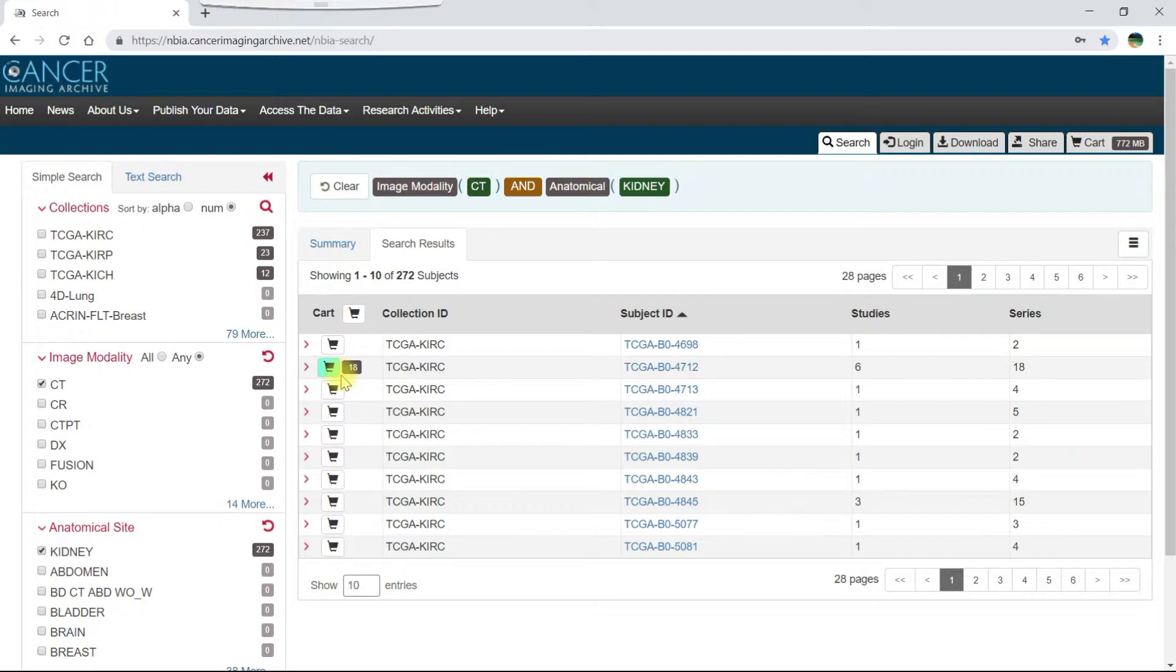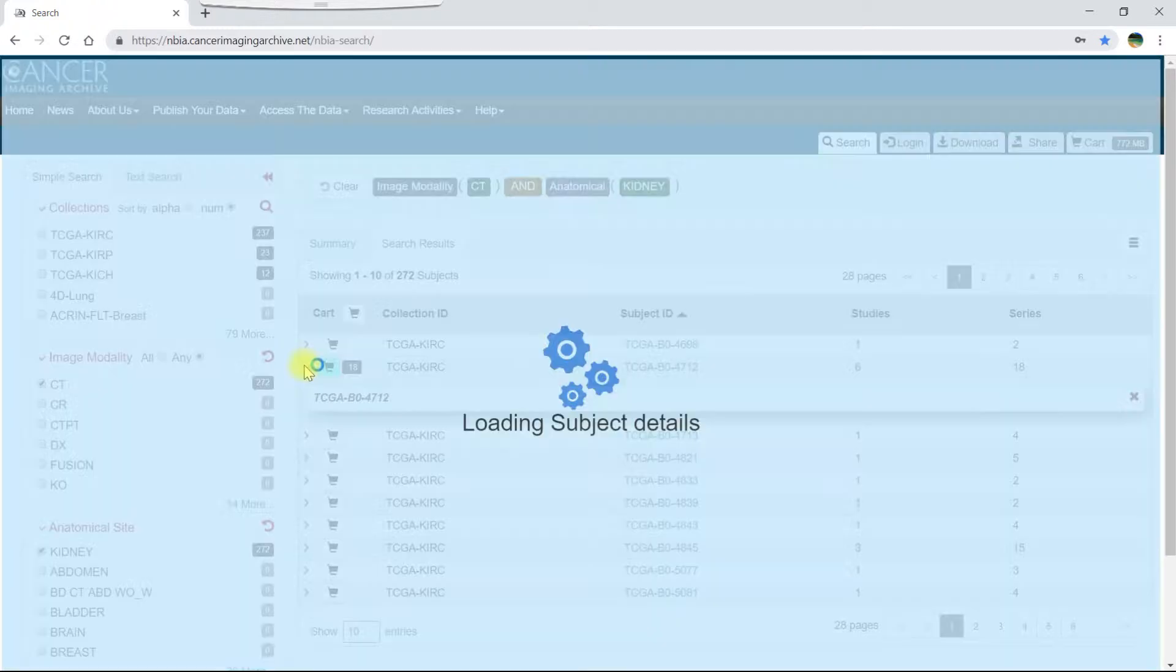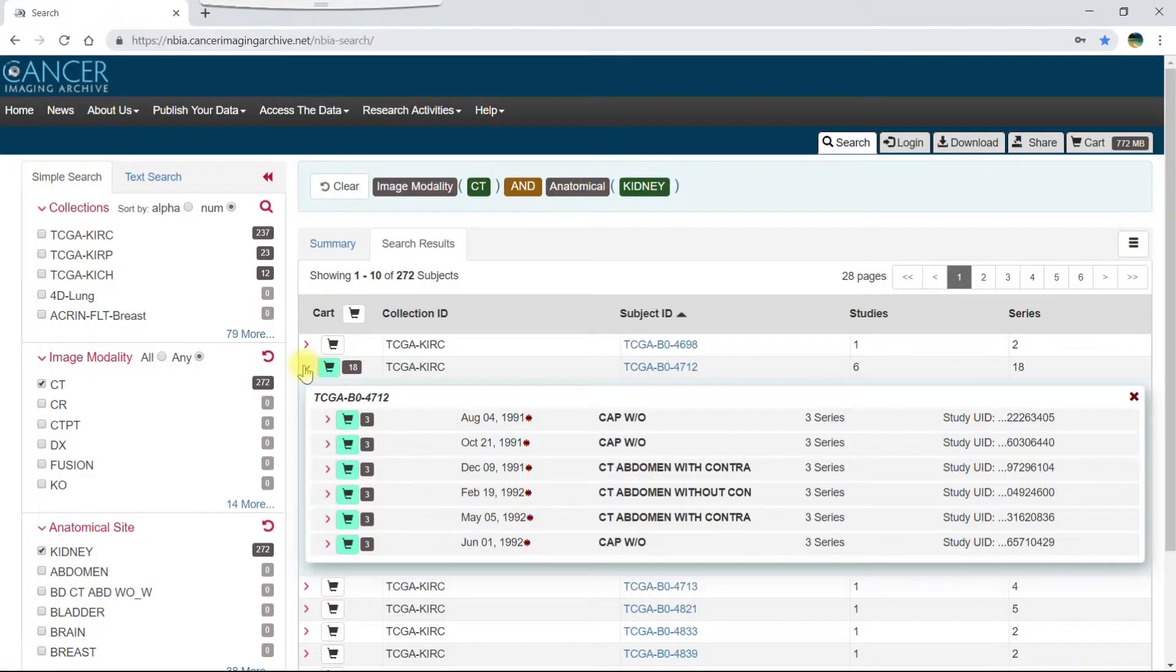Now let's drill down further to a single study or time point and select individual kidney scans. First click the arrow to the left of the cart icon to view details about the subject. This shows you all of the studies or time points for that subject.